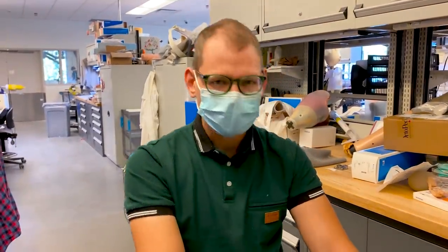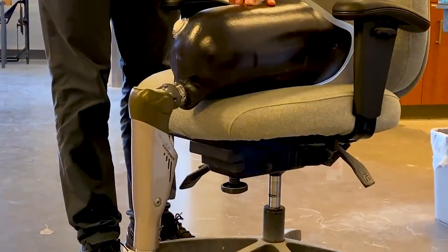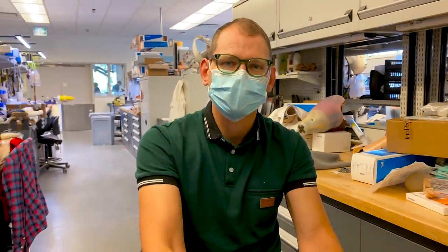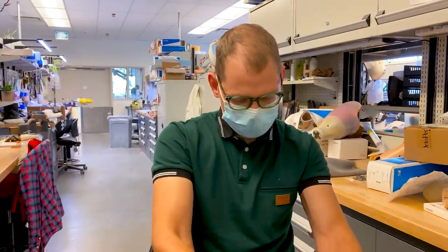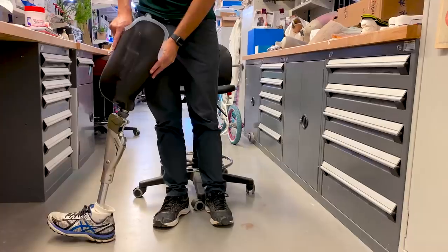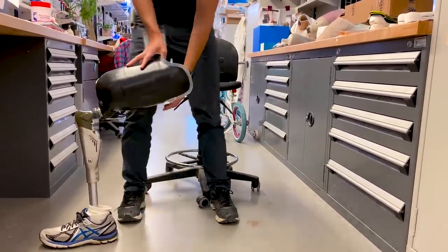So the way the knee joint works is, this is a bit of a special prosthesis in that it has a knee that's controlled by a computer. So the computer helps tell the knee when to bend and when to stay straight. So you want the knee to be straight whenever the person has their weight on the prosthesis so they're not falling. Whenever the prosthesis is picked up for swing phase, typically the knee wants to bend. So the computer helps to tell the knee when to do that. And it does that by sensors inside of the knee to help it stay stable or to allow it to bend for swing phase.